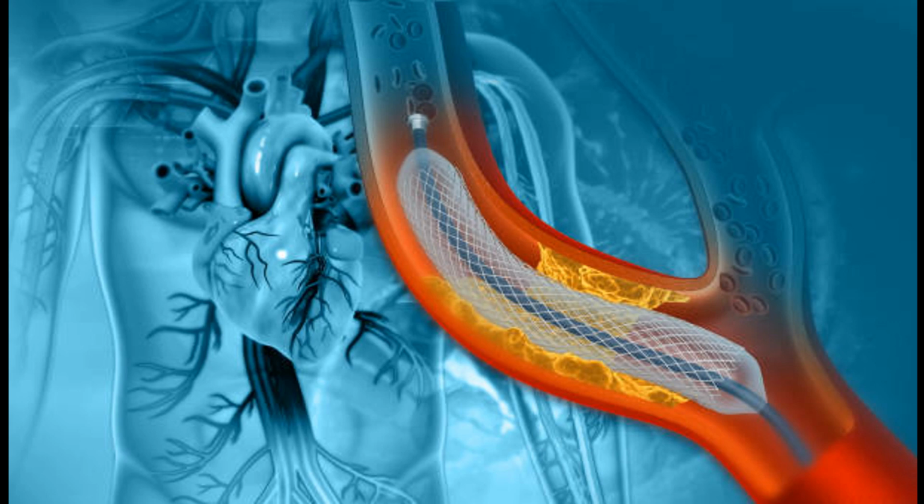Guidewire placement. A guidewire is advanced through the catheter to the site of the narrowed artery. This helps the catheter reach the precise location of the blockage. Angiography. A contrast dye is injected through the catheter into the arteries. X-ray imaging. Angiography is used to visualize the blood vessels, including the location and severity of the blockage.